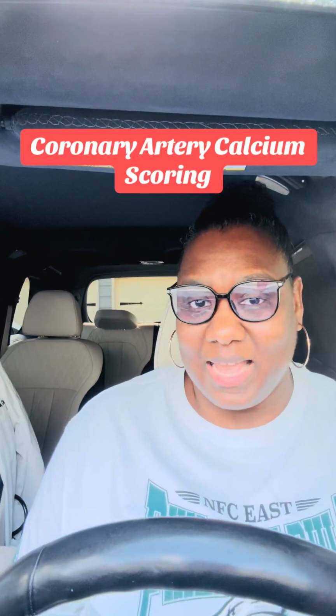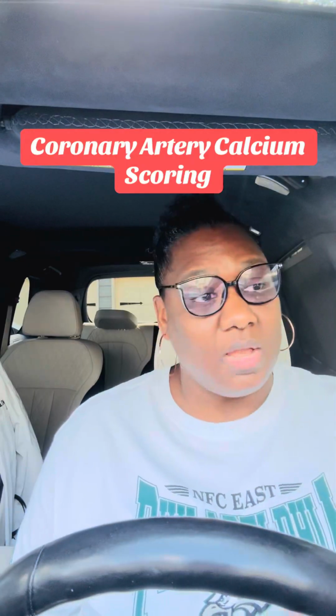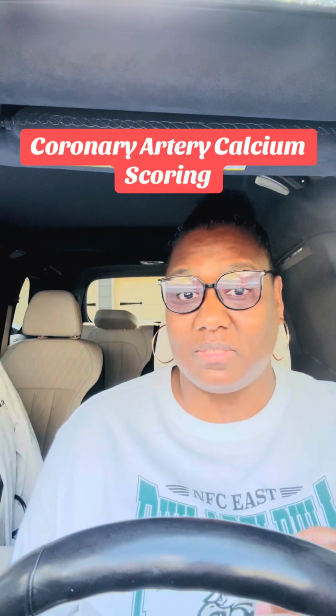So you don't have to worry about that part. Best case scenario when you get this calcium scoring done is that you have a 0 score. No calcium deposits discovered. Beautiful. A 0 calcium score means no coronary artery disease.